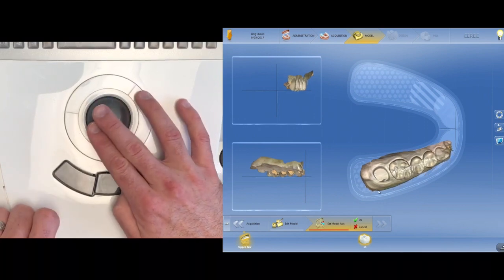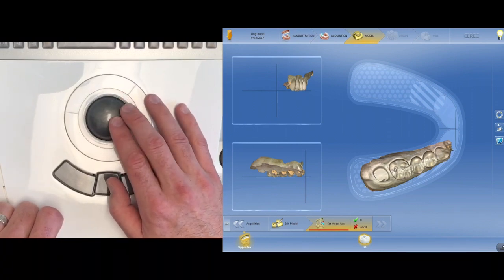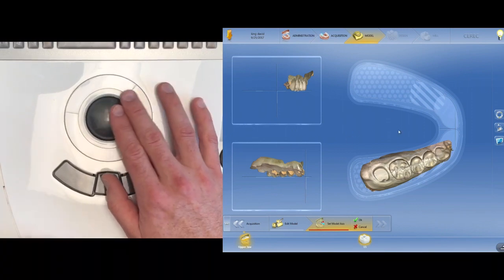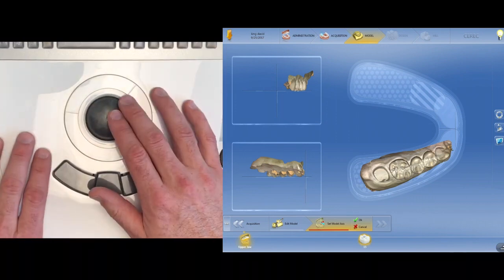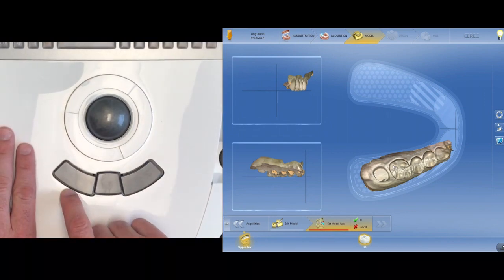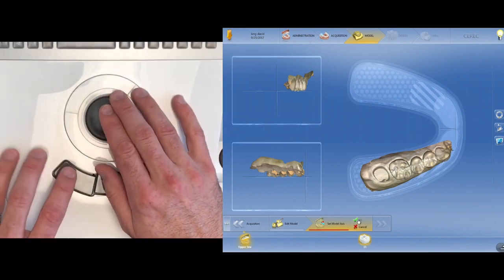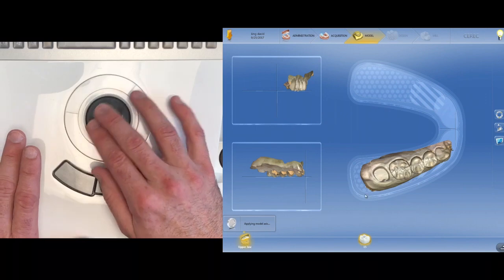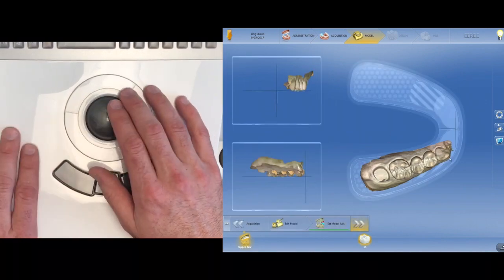You can spend hours and hours fine-tuning where you want it positioned. For a single restoration, it's not really critical as long as it's in the right quadrant. But you can see here now that we have it positioned right. And we used our pan on the right and our rotate on the left, and our zoom button was not effective, not active in this screen. So let's hit OK. This is our new model axis, upper left, single crown. We're going to move forward.